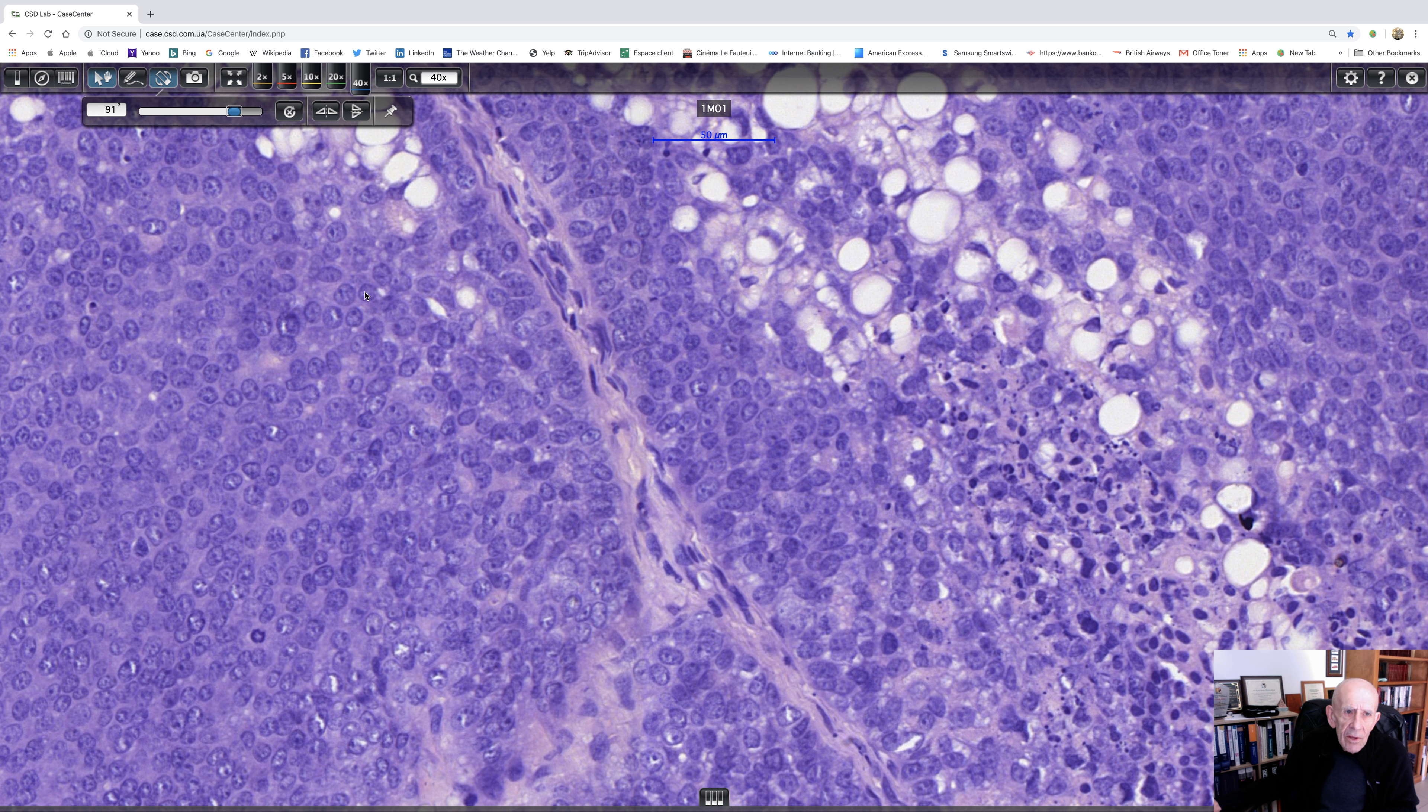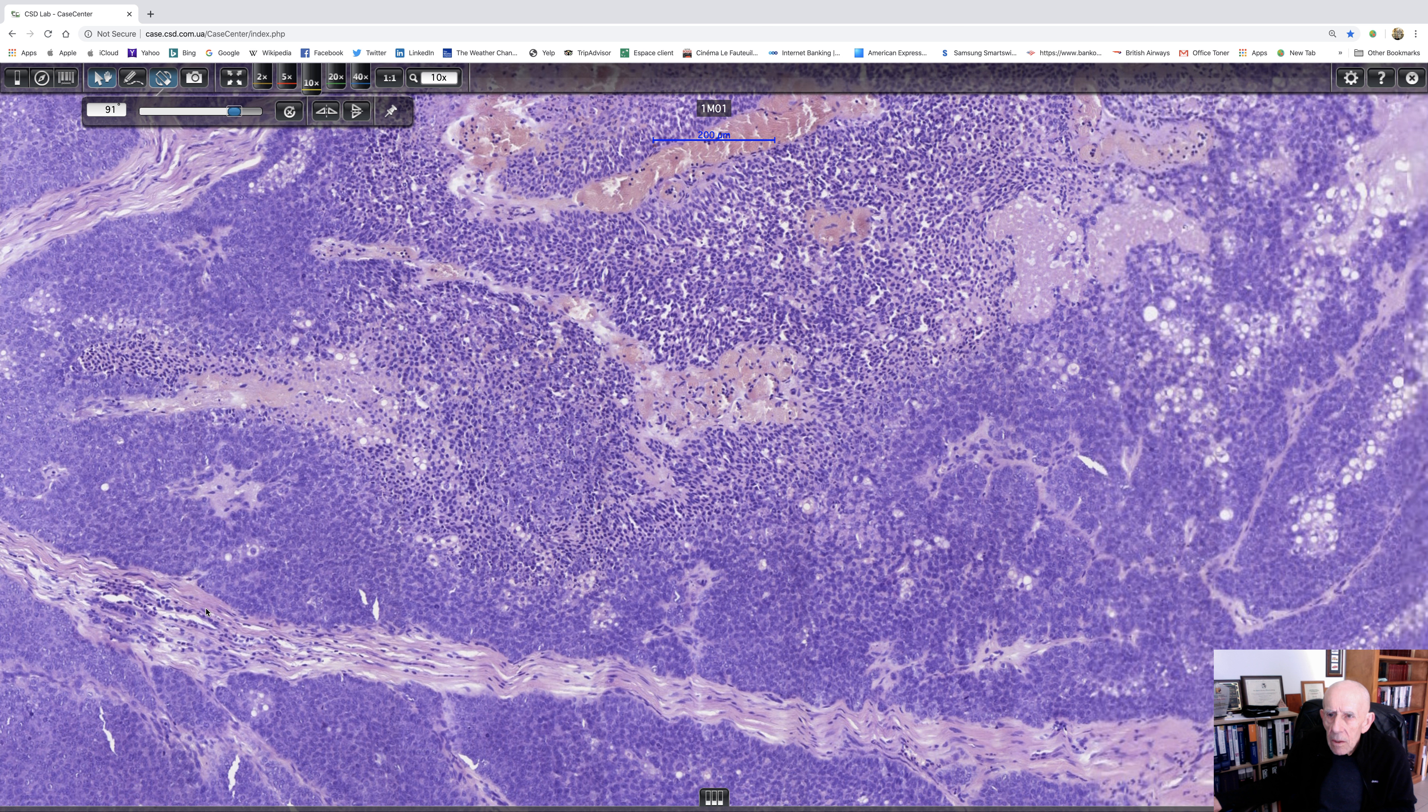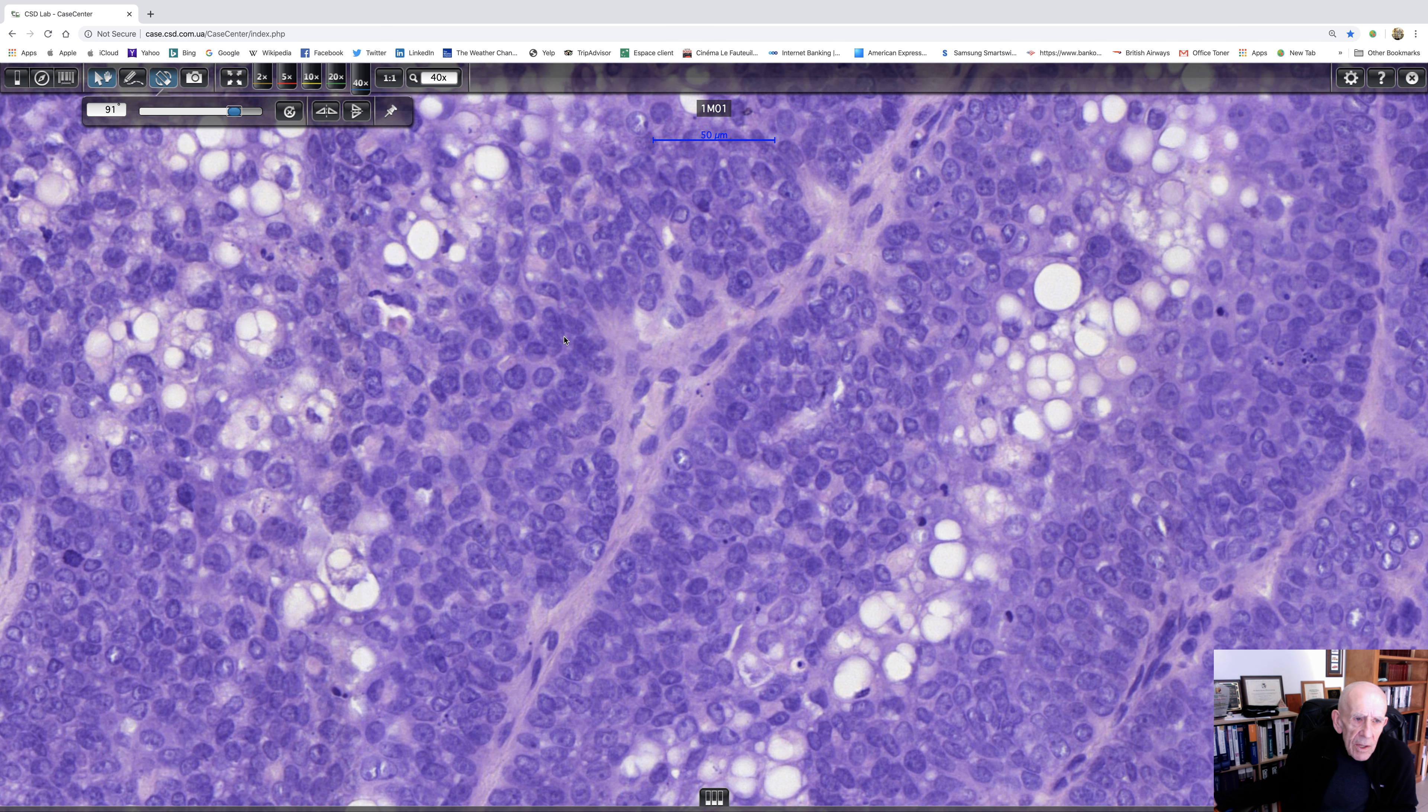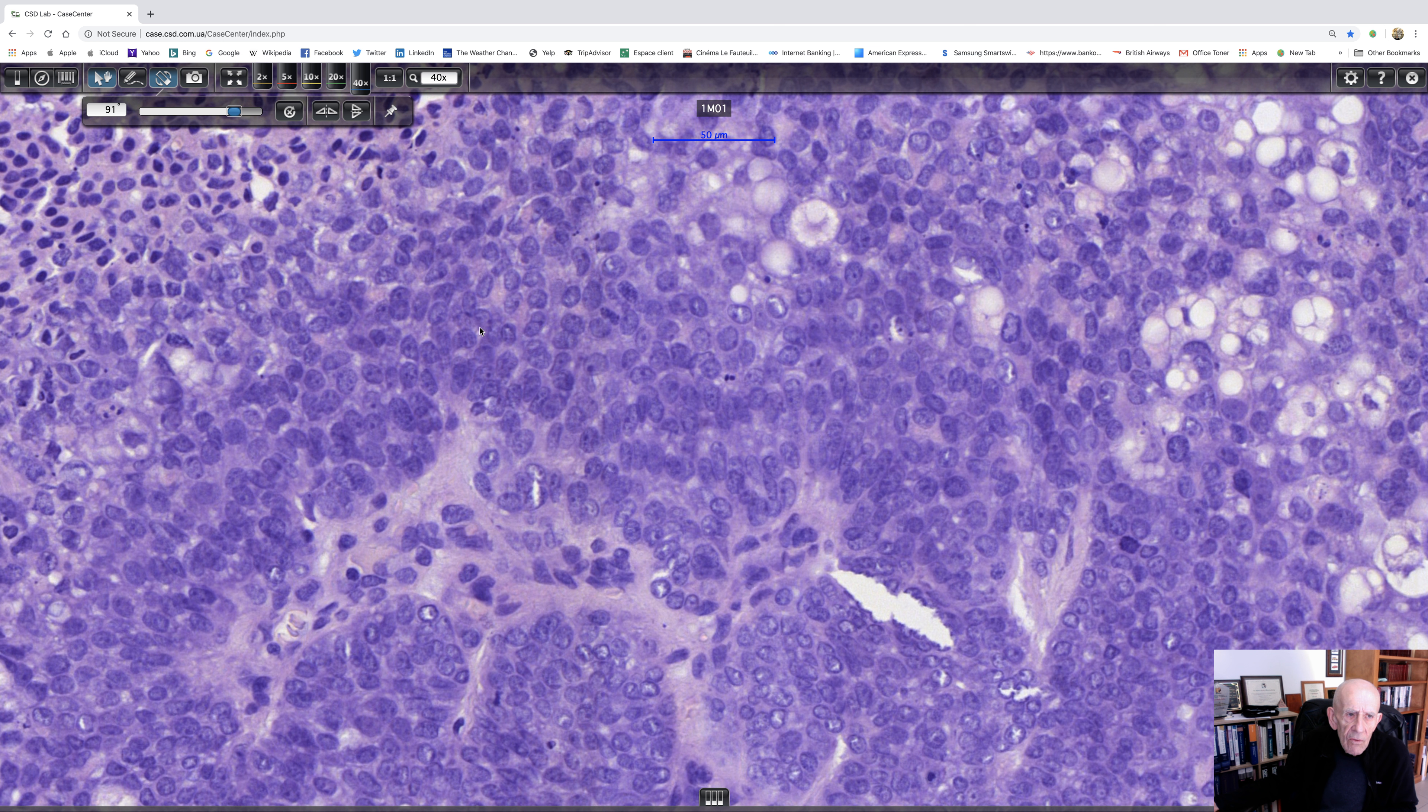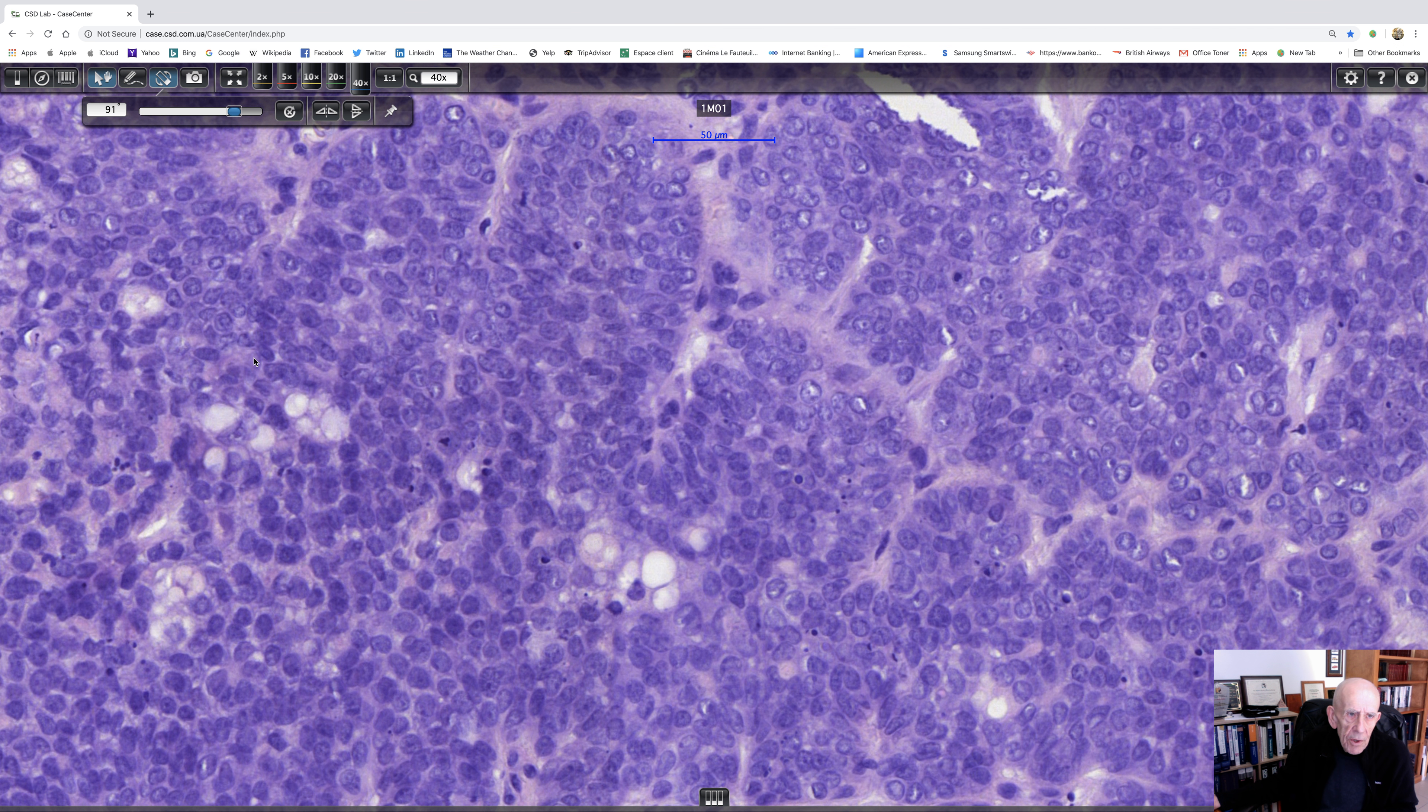And let's just look at other fields to get an overall sense of what's going on. There's a nice field there where there's nice vacuolation. See if we can pick up more sebocytes. Oh, indeed, we have. There are more sebocytes there. And there are lots of mitotic figures. The tumor is teeming with them. So I don't think we really have a problem making a diagnosis in this case. This is clearly a sebaceous carcinoma. I don't have a differential diagnosis. So that's what it is.